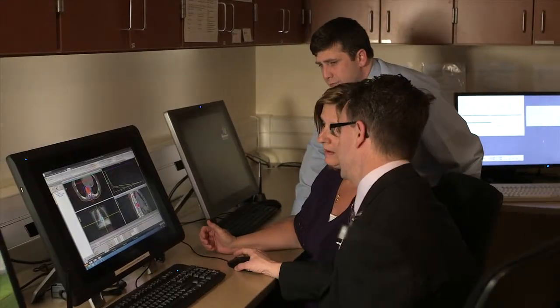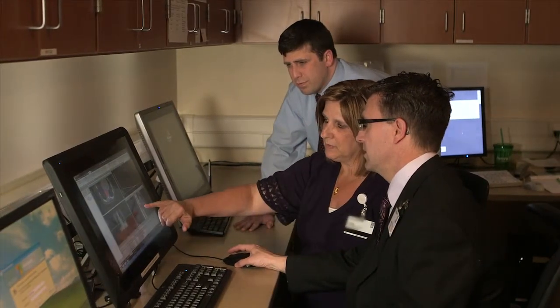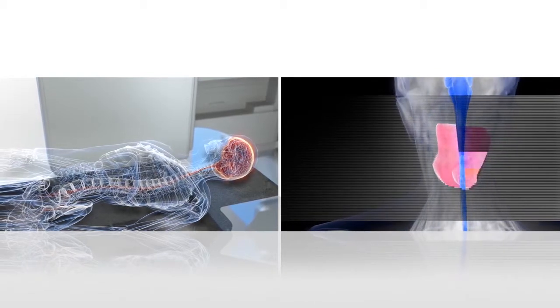After your consultation visit, your physician needs to verify the exact size, shape, and location of your tumor so that your precise radiation treatment can be planned. Since brain and spine tumors are often small and located near sensitive structures, it is critically important to gain highly accurate measurements. After a patient is seen in consultation, if it's been determined that he or she would benefit from radiation therapy, the first step is what we call a CT simulation. That's where we send the patient to our CAT scan machine and obtain a mapping scan, basically a CAT scan through the area of interest where the tumor lies. That information then gets transferred to the treatment planning computer, and that's where we go to work to design the radiation fields.